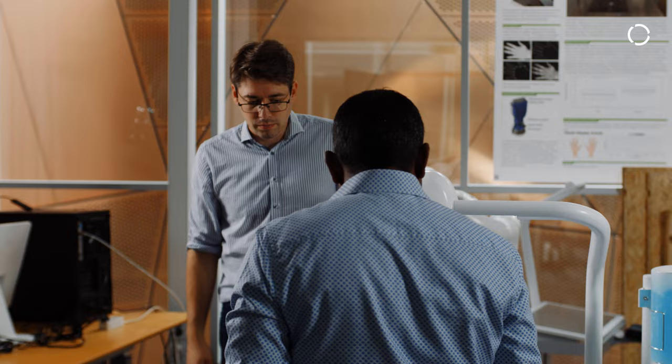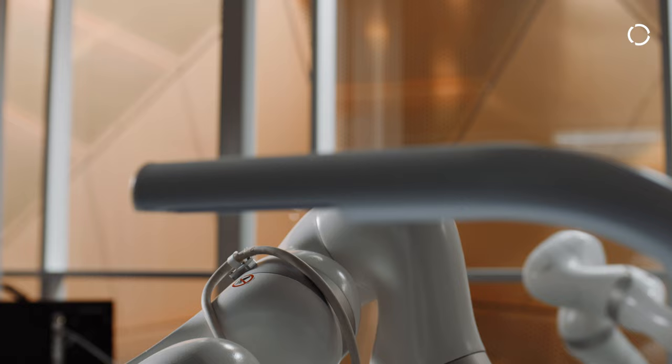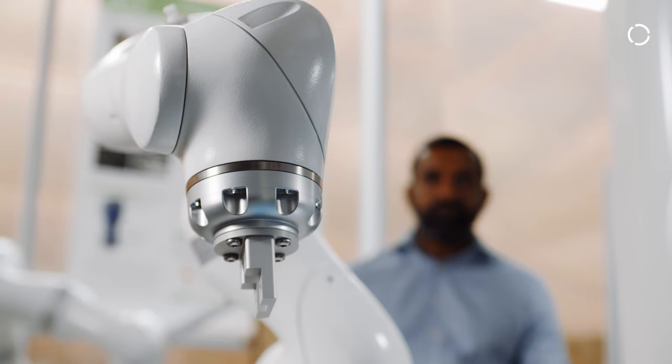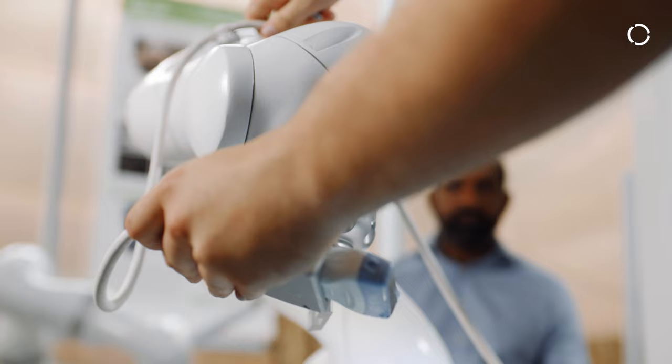When we were developing Robka, we started using local robots. We realized that if we wanted to take it all the way to market, we needed a robot that had the right certifications and functionalities, which could lower the barrier to market entry. KUKA had all this combined in one product, the LBR Med, so we decided to go with it for the final product.